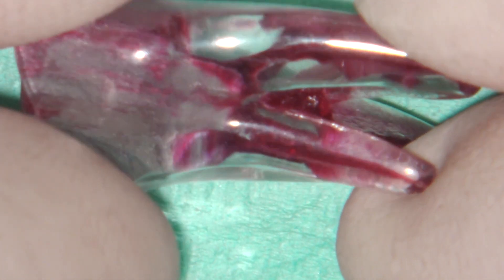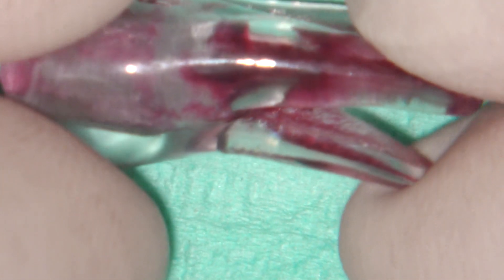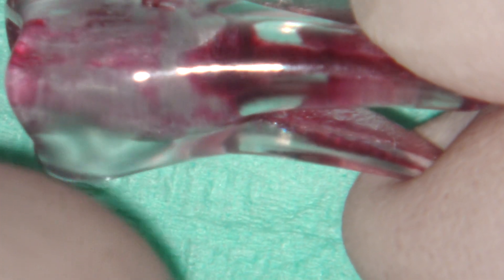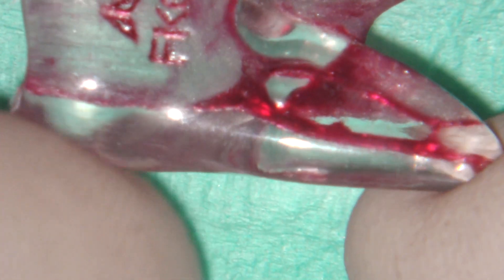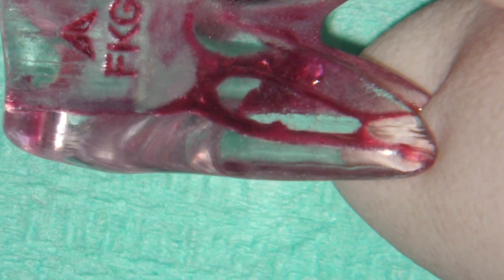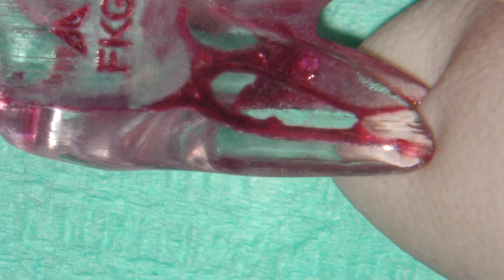I am using the mesio-buccal root of a plastic model obtained by 3D printing. This is only a rough approximation of in vivo conditions.